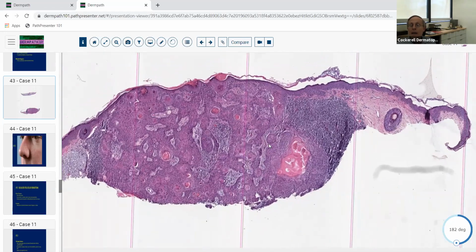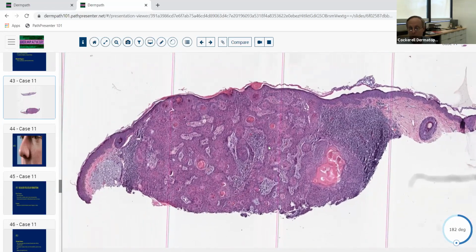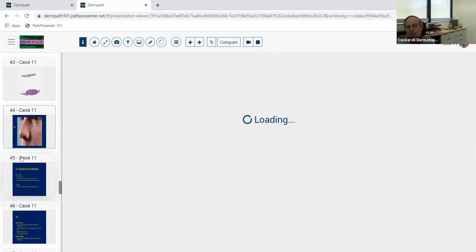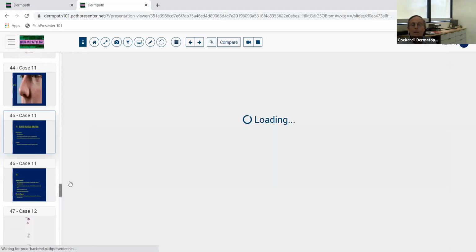A lot of people call them that, but certainly it's in that category of benign follicular hamartoma with some basaloid follicular hamartoma area to it. Once again, you do a biopsy of this, looks maybe something like this. This might be somebody that's got trichoepitheliomas, but this actually is one entity where you can get multiple lesions. So there is a benign basaloid follicular hamartoma syndrome, just like there is a multiple trichoepithelioma syndrome. So they both can be seen in a syndromic fashion.